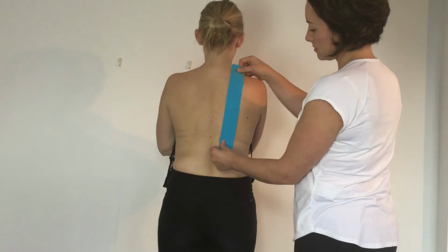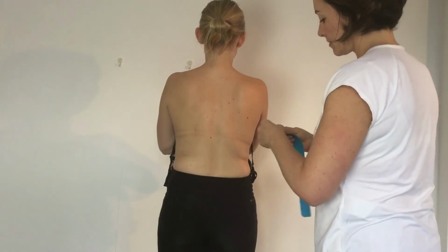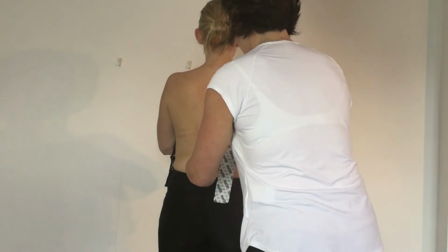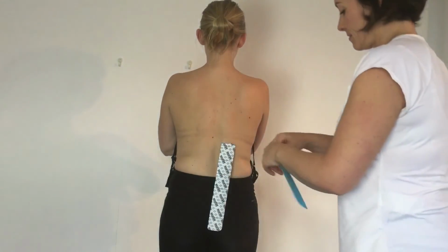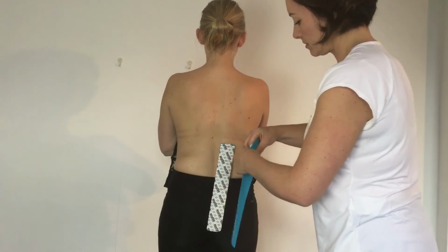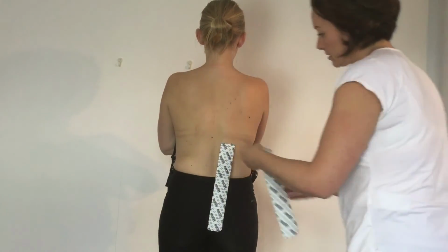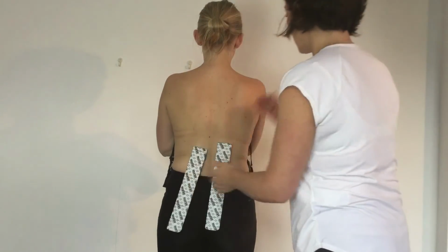We're going to use quite a long anchor, so maybe at least 3 inches of the tape, and we're going to anchor at that thoracolumbar junction with no tension. We're going to do this taping on both sides. So we're going to anchor 2 pieces of tape at that thoracolumbar junction. Anchor with no tension, tissue is not on stretch.